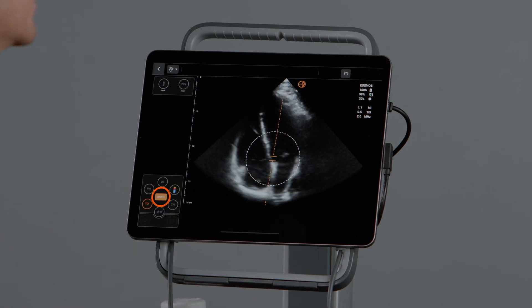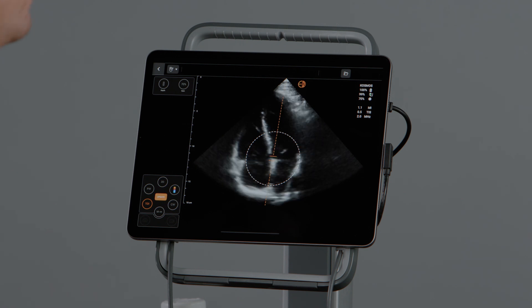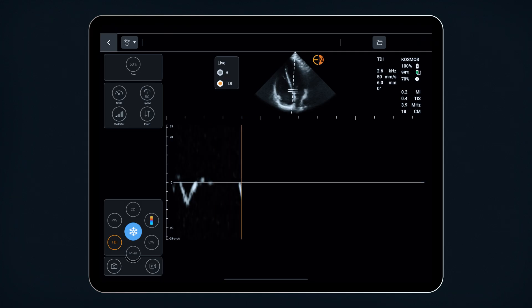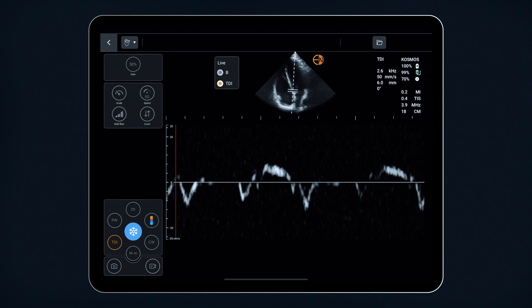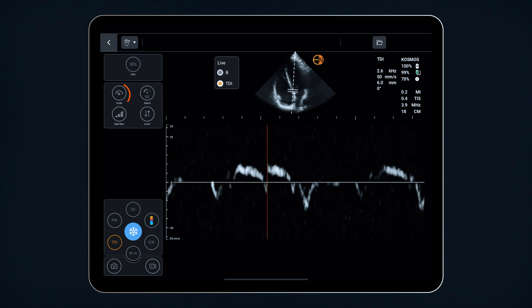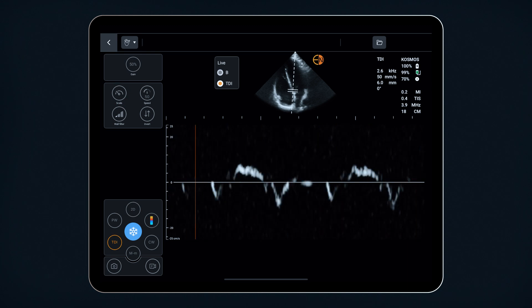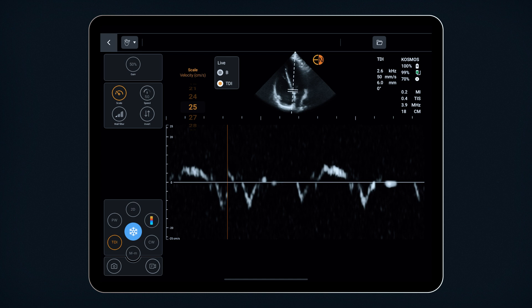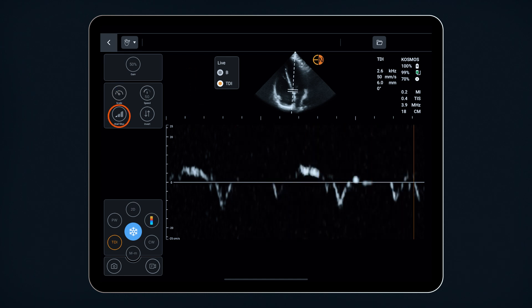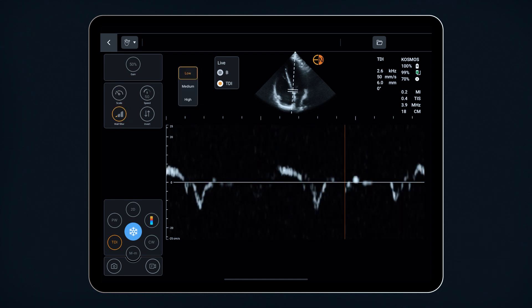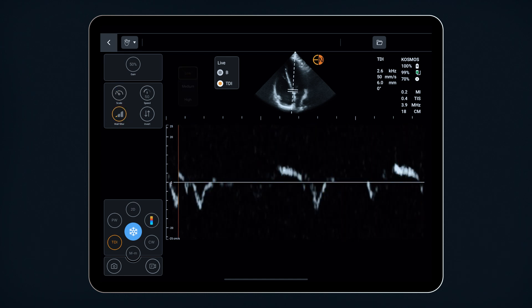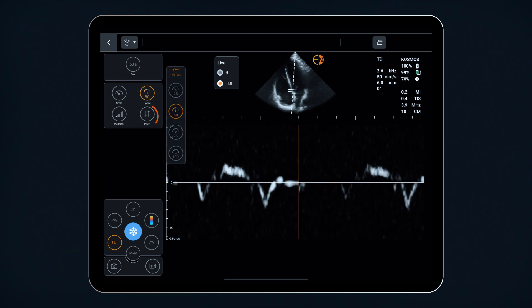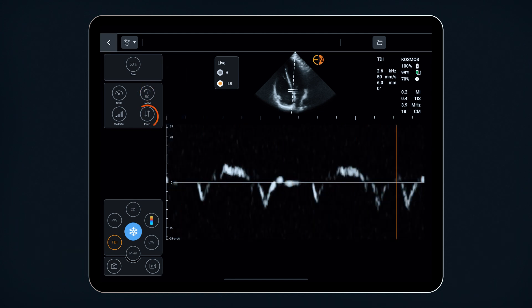Select update to activate TDI and your waveform will appear on the screen. You can optimize your waveform by adjusting the scale to capture different velocity ranges, adjust the wall filter to reduce noise, adjust the speed, and invert the waveform if needed.